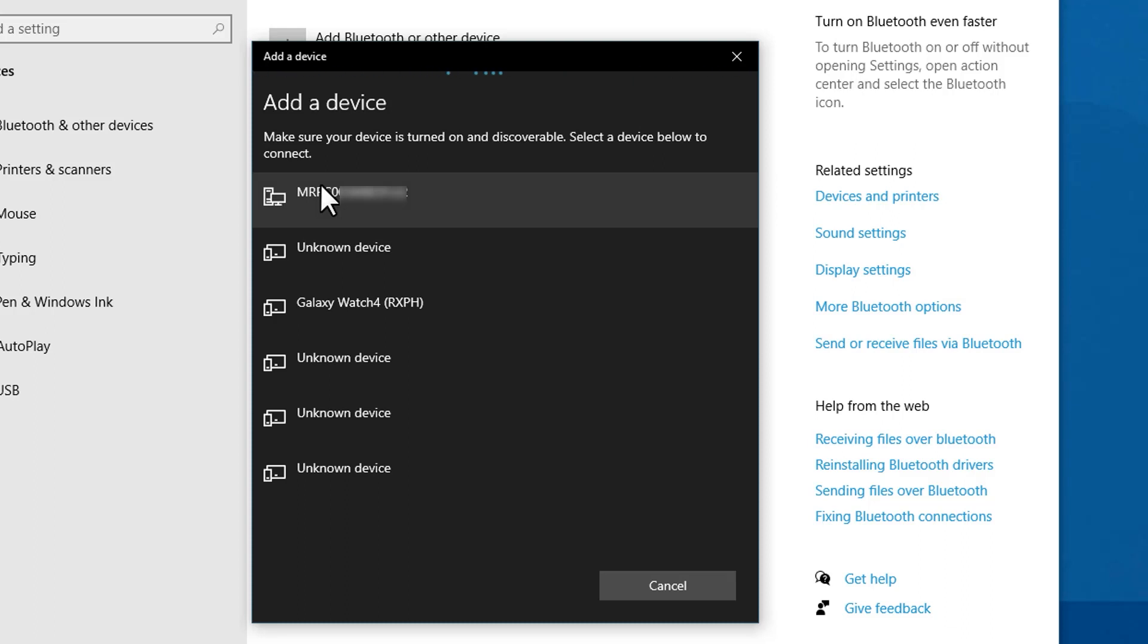Meanwhile, activate the simulator's pairing mode. The method for activating the simulator's pairing mode may vary by model. Check your User Guide for more information.